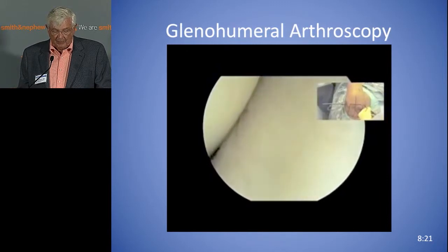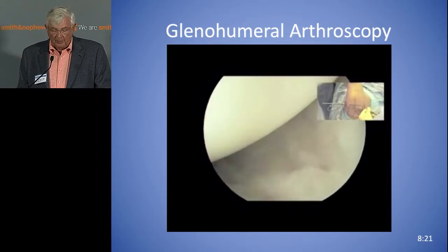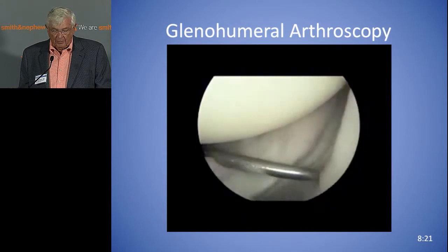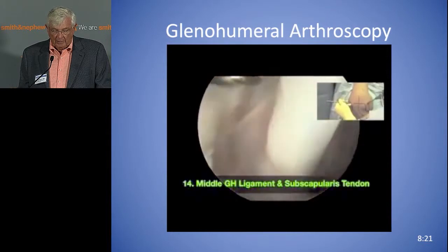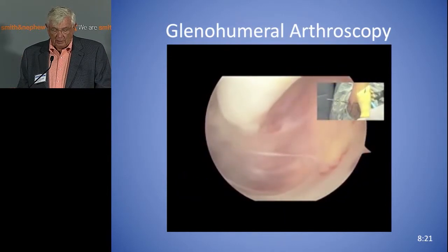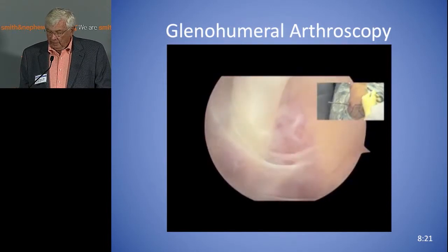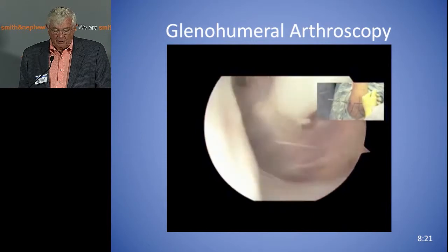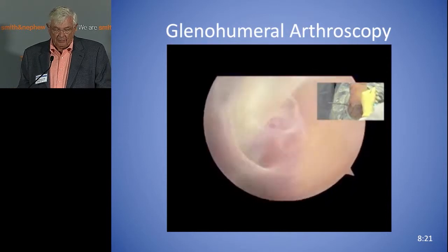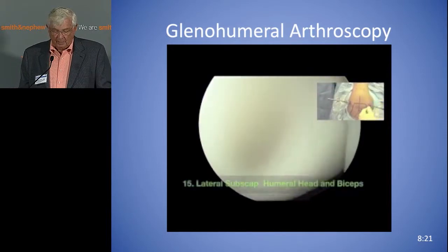The subscap is on the right. There are two things to do with the subscap: one is to look up above at its attachment, and the other is to look down. There's the middle glenohumeral ligament with the probe. Now you just duck right into the subscapularis recess — looks like a colonoscopy. That's where the loose bodies hang out, so you need to be able to look in this area. You're going to drop a loose body in there someday and not be able to find it, and you'll be very frustrated — especially when you get a post-op x-ray and the patient asks why it's still there.